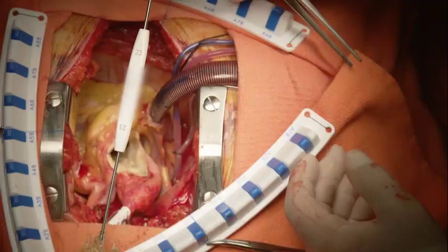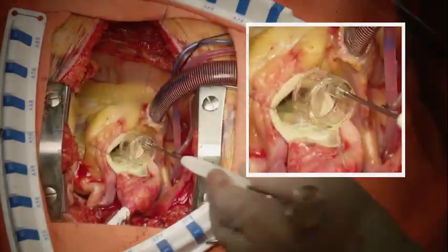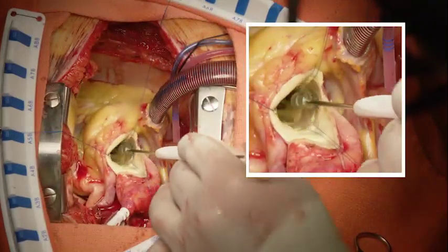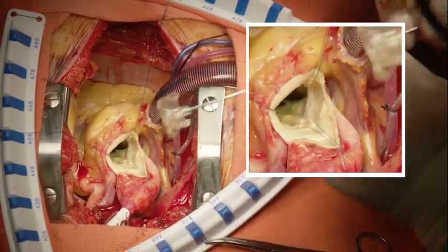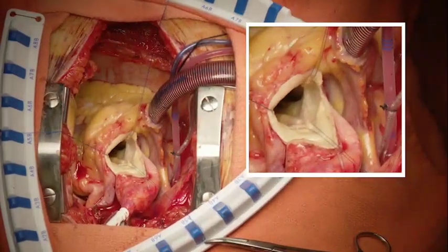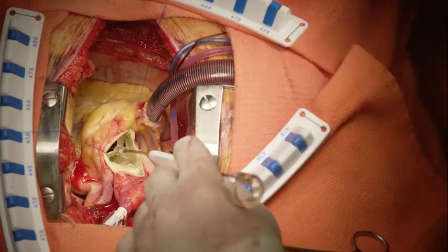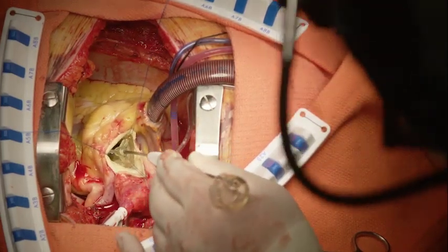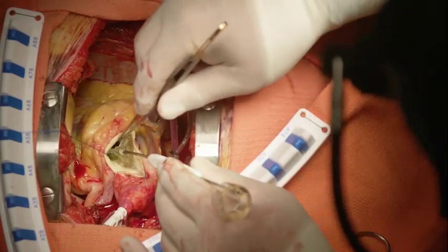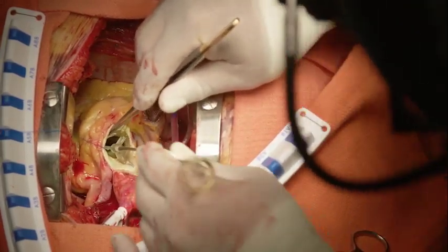This is a 23-millimeter Avalus sizer. The barrel sizer easily goes through the aortic annulus. An appropriately sized Avalus valve for any particular aortic annulus or aortic root should fit firmly into the root and have minimal to no sinus tissue protruding into the left ventricular outflow tract lumen. The 23-millimeter replica sizer fits well, with minimal tissue visible underneath the sizer once seated in place, indicating this most likely would be an excellent fit and the appropriate size.